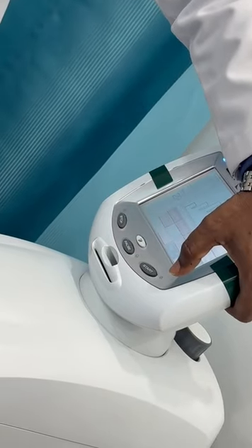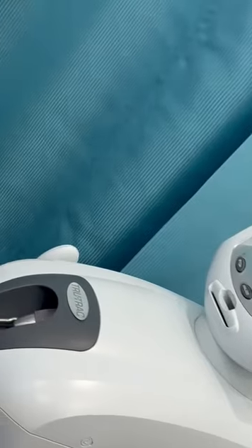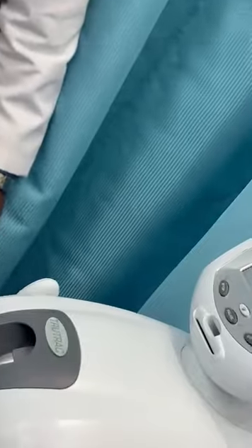These are the safety procedures you must follow. Once everything is done, keep the patient on the side-lying position for 1 minute, and then make the patient sit. Ask the patient to sit for some time, check whether the patient has any kind of giddiness. If nothing is there, then you can send the patient. Then give the home program and you can leave.